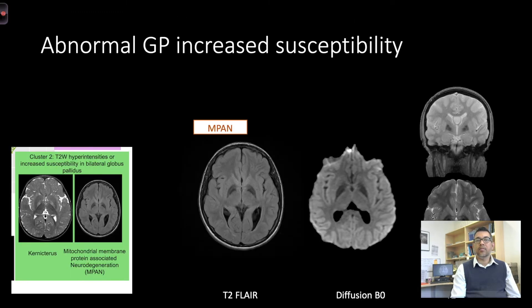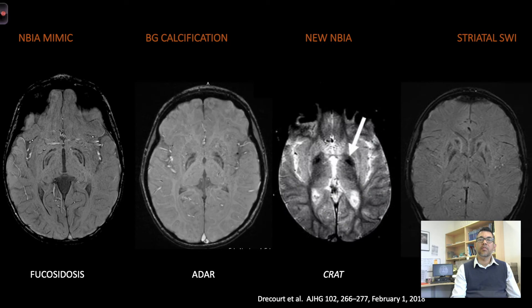Other than T2-weighted hyperintensities, some disorders grouped together in cluster two because they had increased susceptibility on MRI, and these included classic brain iron accumulation disorders like MPAN. It is important to note that a similar pattern can be noted in various other disorders, including NBIA mimics like fucosidosis, those with basal ganglia calcification, or those with other metal depositions that can lead to striatal susceptibility such as Wilson's disease.